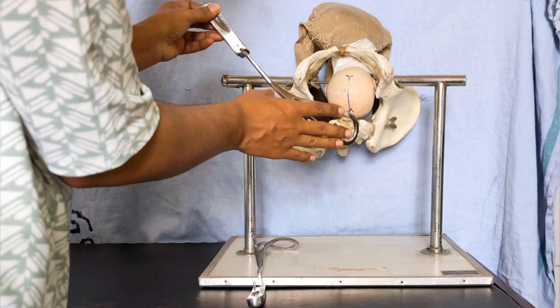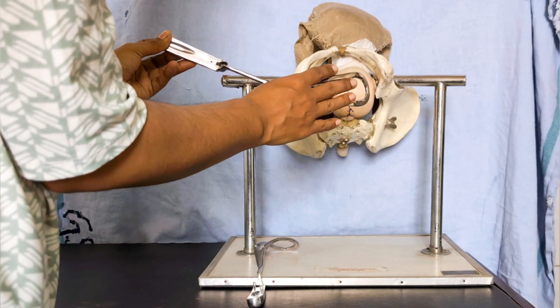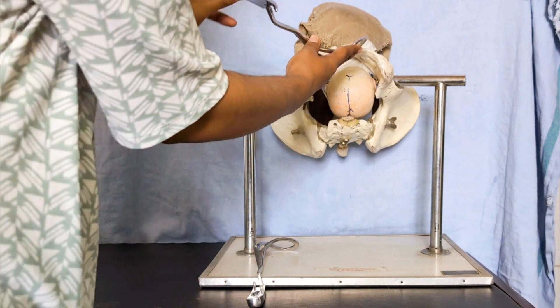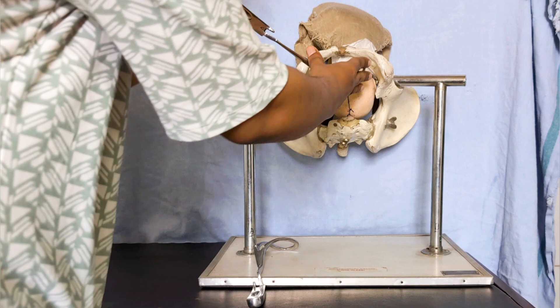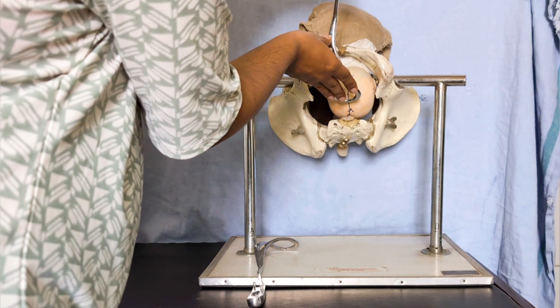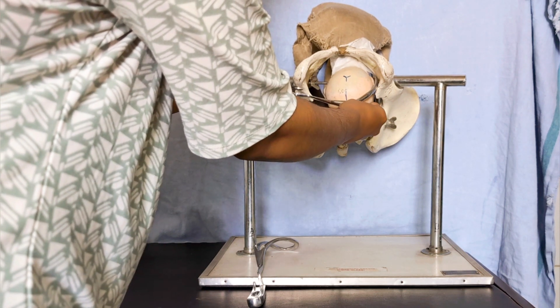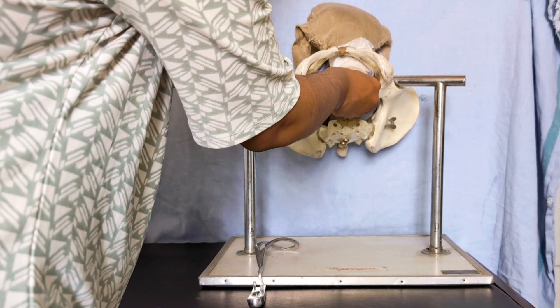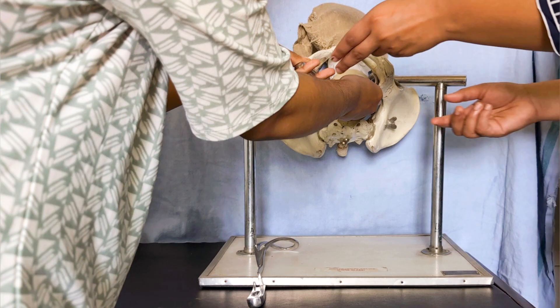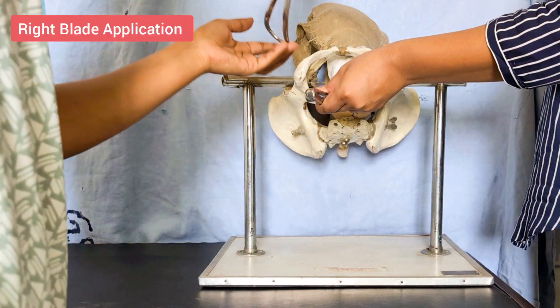Guide the blade along the posterior vaginal wall, then slightly arch it along the lateral vaginal wall. The right hand helps guide it — keep the thumb on the heel of the blade and the rest of the fingers on the blade to guide it along the left vaginal wall.